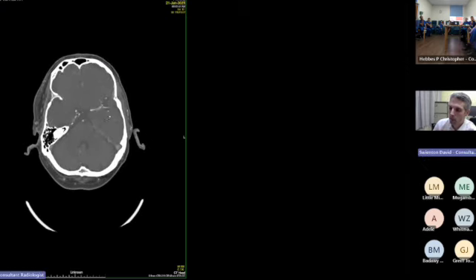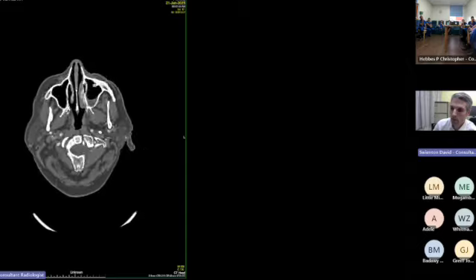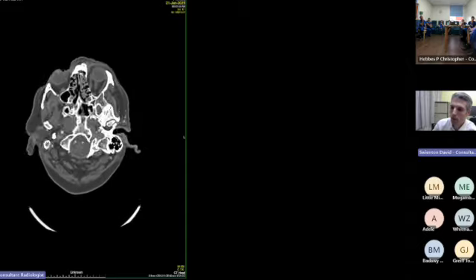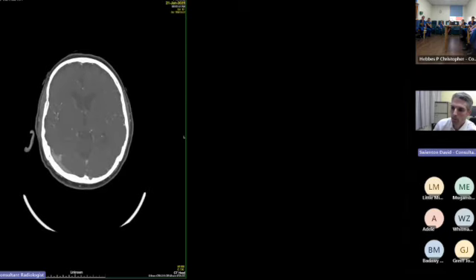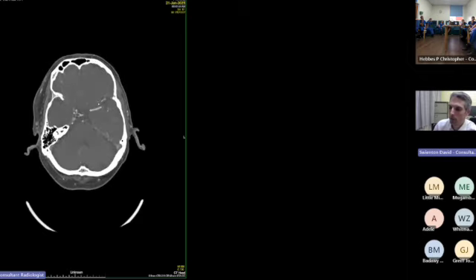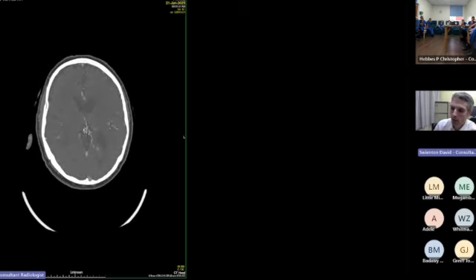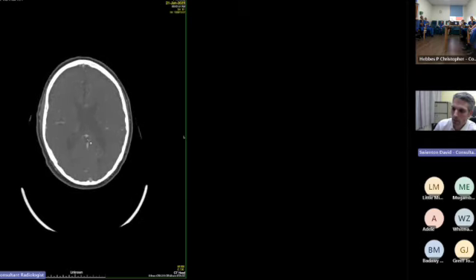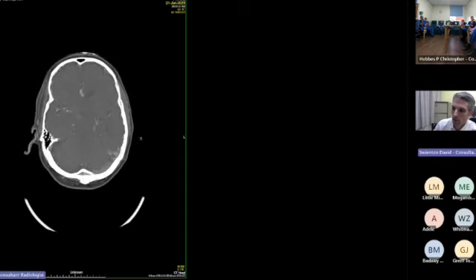So there's CTA. So what are you looking for in the brain death studies? The opacification of the external carotid arteries. So you're looking for these out here. The temporal arteries are the ones that are used, and you can see those well opacified. Obviously, this person doesn't have raised intracranial pressure, so you're seeing very nice intracranial opacification as well. Even at this relatively early stage, you can see the internal cerebral veins. So here they are, these paired structures sitting just above the third ventricle. They then go back and join and flow into the straight sinus, and then into the transverse sinuses.